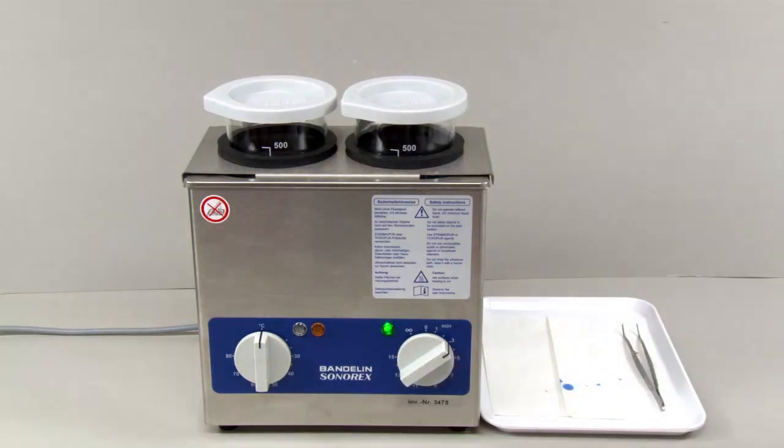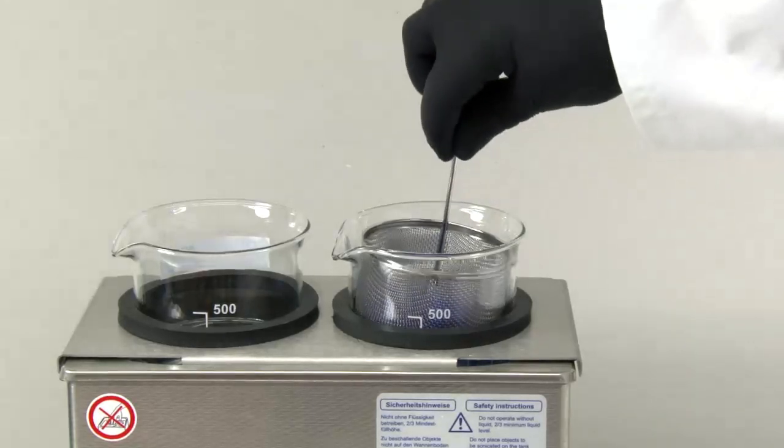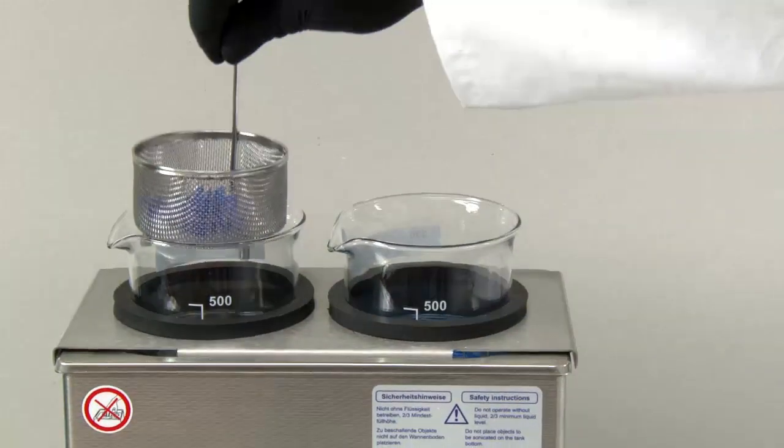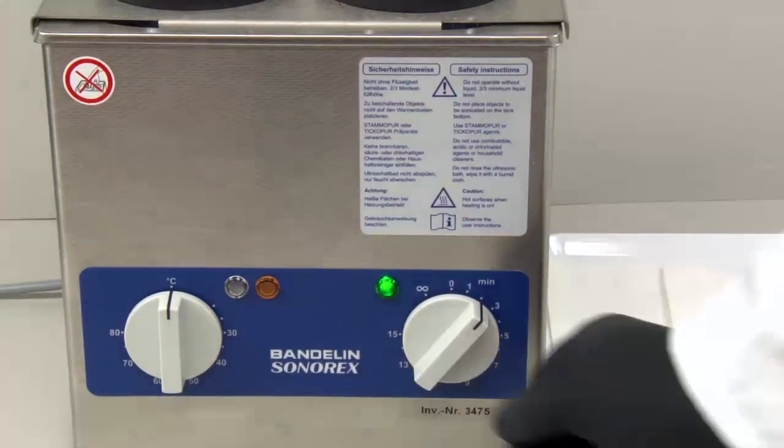The first bath lasts 3 minutes. Then the restorations are placed in the second tank, where they are cleaned for another 2 minutes.